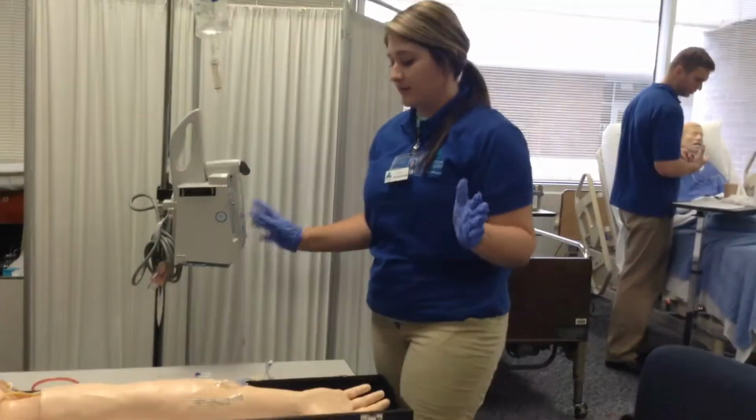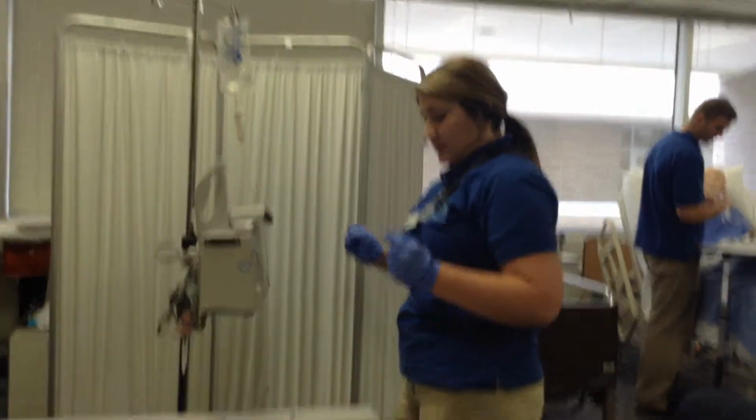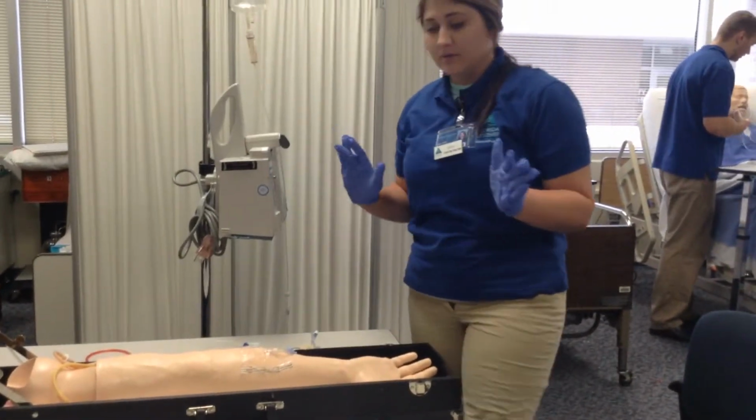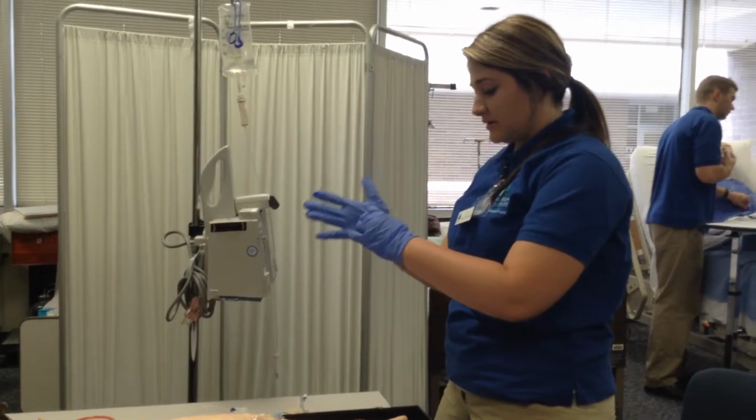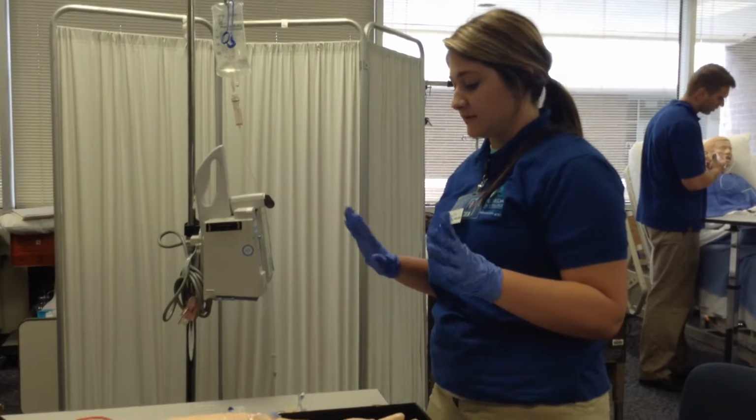Then I would reset the flow rate back to the physician's orders after the primary bag of the IV. Then I would dispose of everything correctly. Of course, the needles are disposed of in the sharps container, and I would empty that one at 2/3 full. I would monitor the IV site, make sure no phlebitis or infiltration.